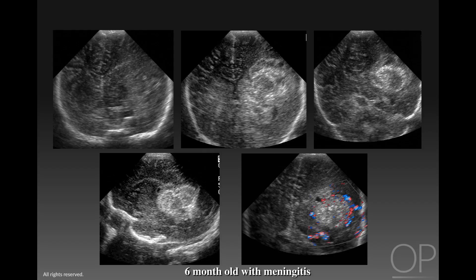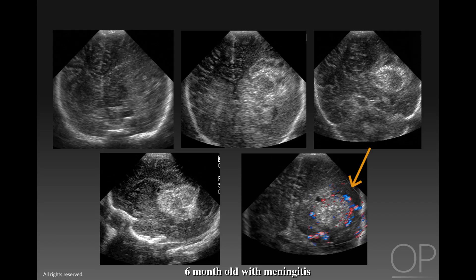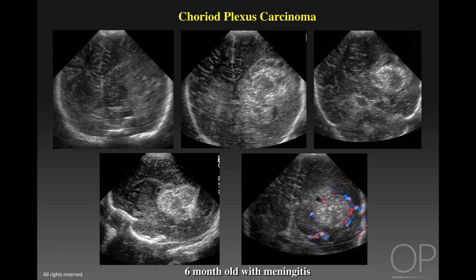Finally, we have another child who presented at six months of age with the clinical diagnosis of meningitis. We see a very heterogeneous echogenic mass in the left hemisphere. Initially, this was thought to be a hemorrhage. However, on color Doppler sonography, this echogenic lesion has hyperemia and flow within the lesion — so it cannot be a clot. This child had a choroid plexus carcinoma. These are unusual but can be difficult to separate from a clot without color Doppler sonography.